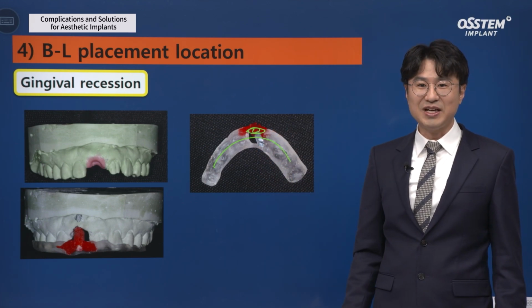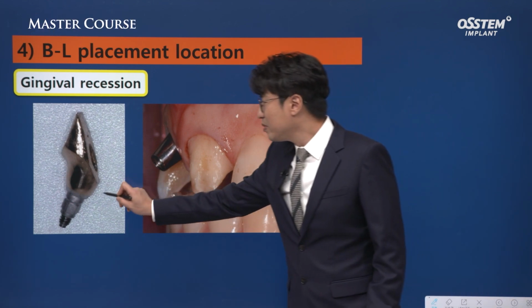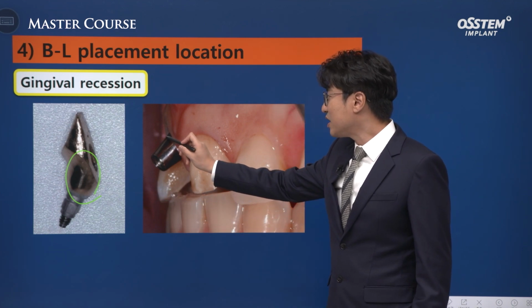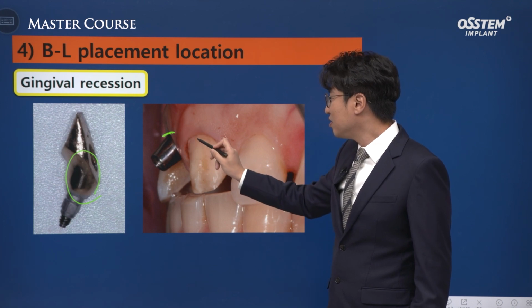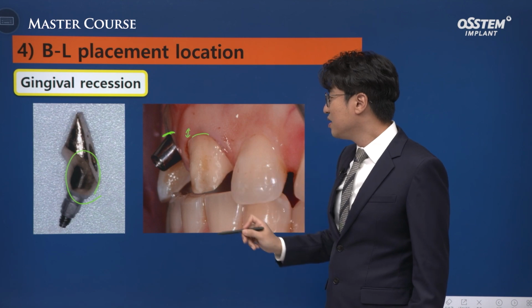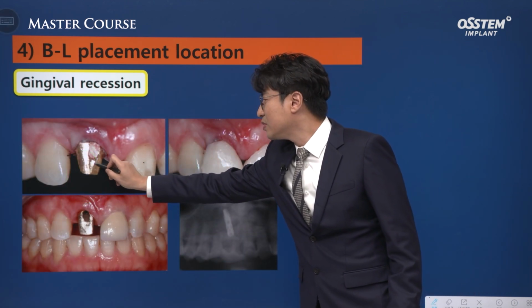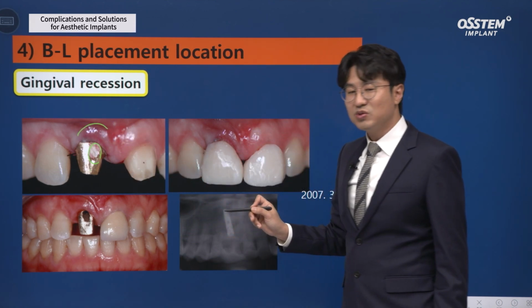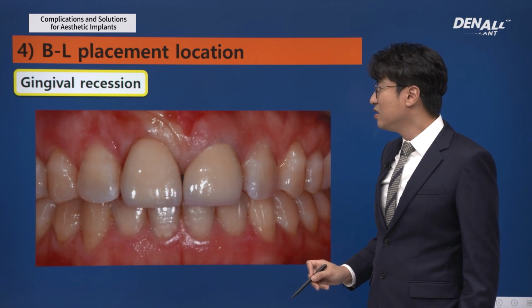Before the secondary surgery, the custom abutment cast was prefabricated, and this was tried in like this. If the healing abutment was connected like this, the gingival level would have been very different. But on the second operation day, the prefabricated custom abutment was connected to prevent the gingival level going upward. So the final prosthesis was completed. I believe this is a pretty good result.